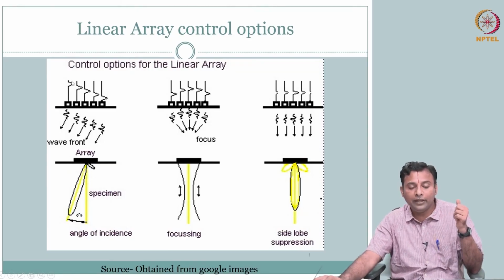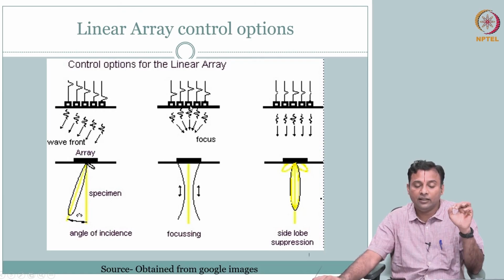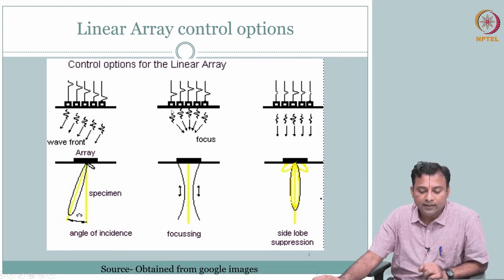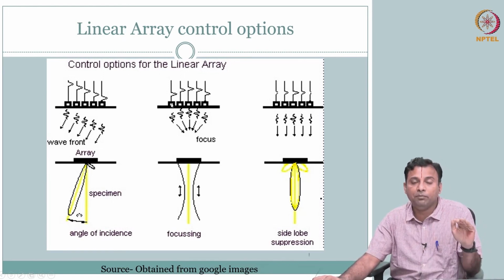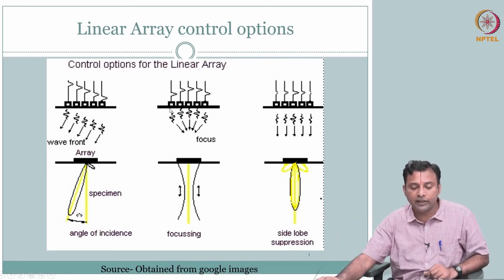Not just that, why do it in a linear fashion? I could delay and excite the elements with a certain pattern such that you have focusing. The concept is very simple. We will cover this mathematically, but the idea here is, it's all very simple. You create a wave. If you excite this, it gives a mechanical pressure wave. This pressure wave is going to start to go out, and the moment it leaves, it goes out in the medium.